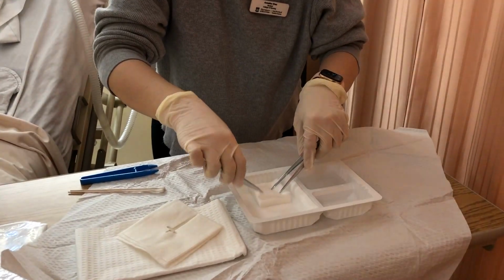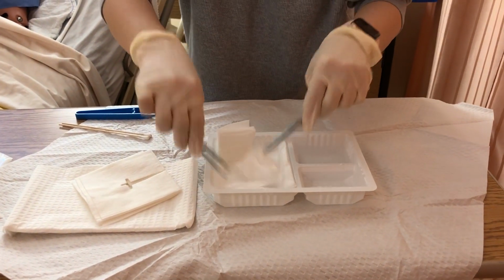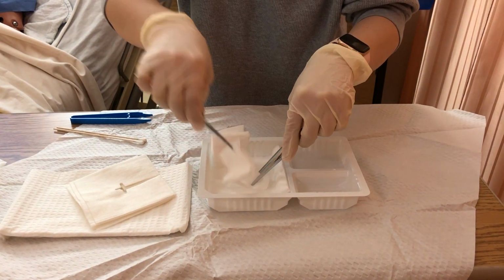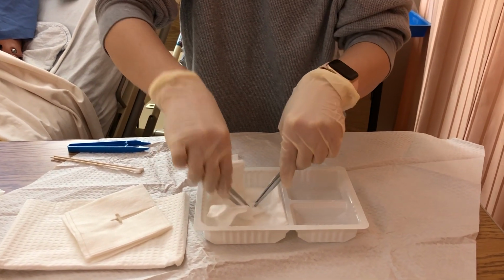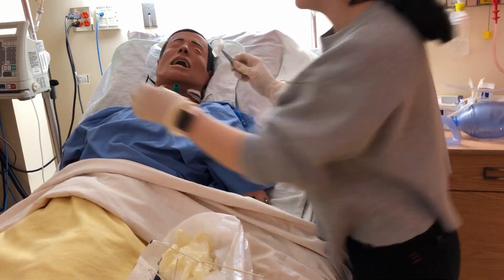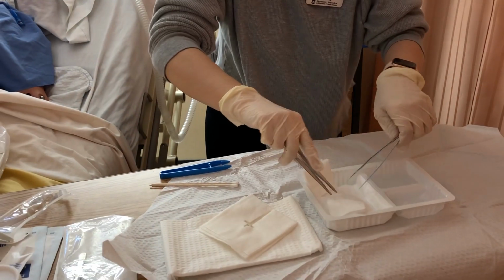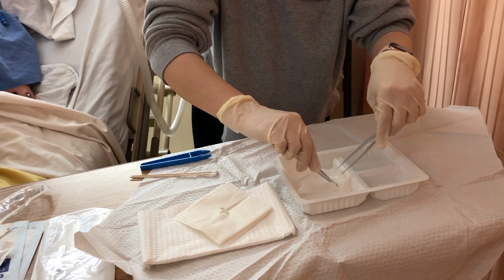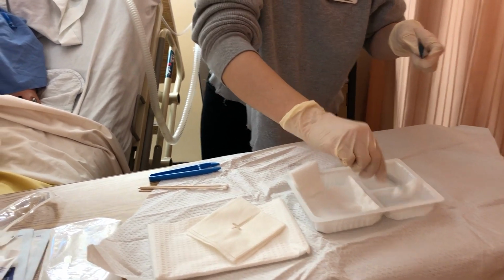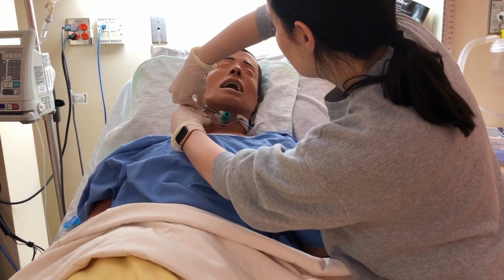Now I'm just going to take some 2x2. Okay, top again.